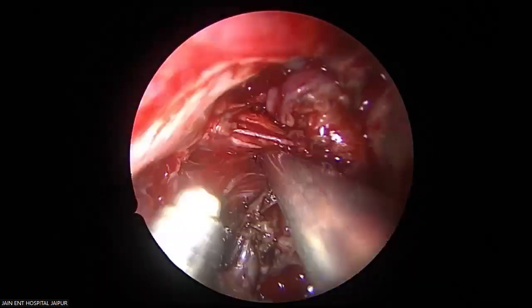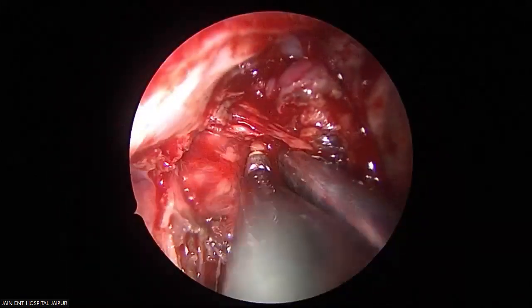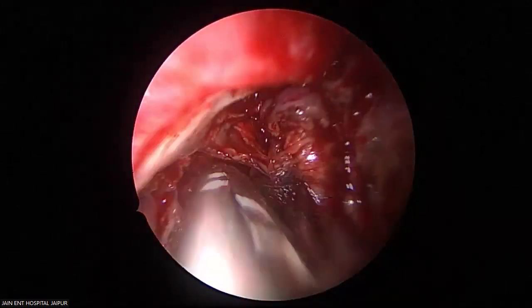Can we get a little more lateral extension by drilling it? No, not really needed. We have ample space.